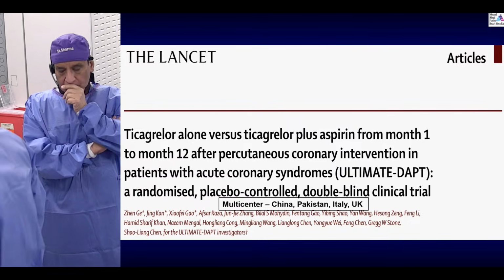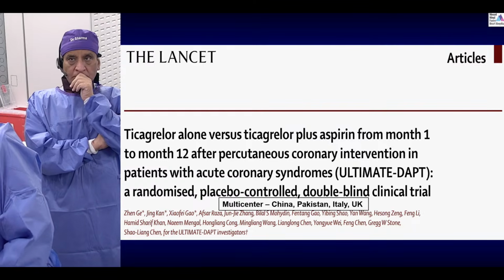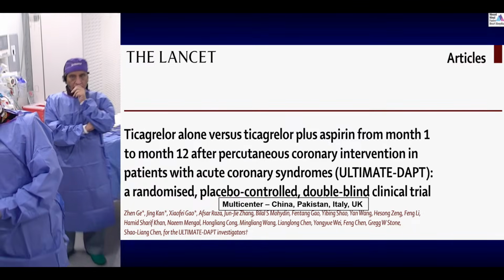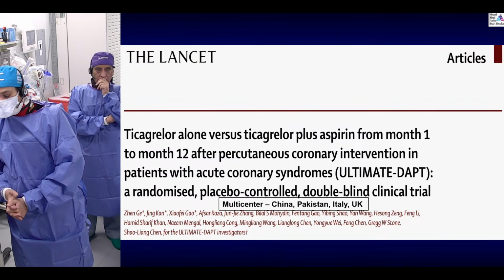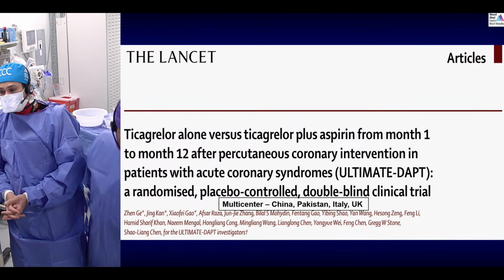If those kind of strict criteria are used, then maybe the vascular closure means we are saying that large bore access is becoming very important, and probably you need a dedicated team and teaching on how to manage this large bore access when you are using Impella and any kind of MCS devices.